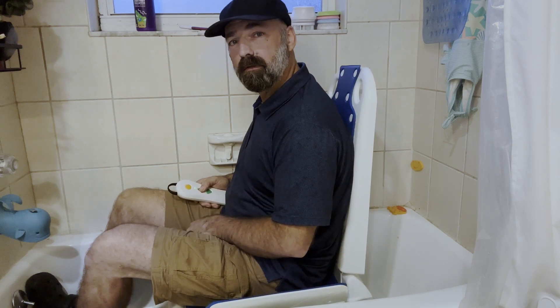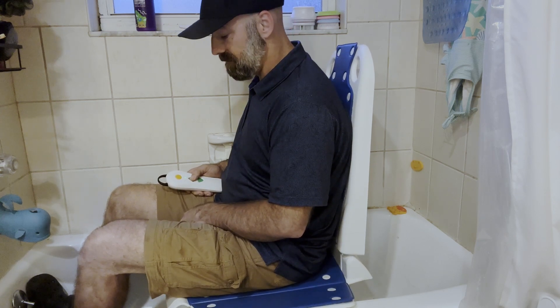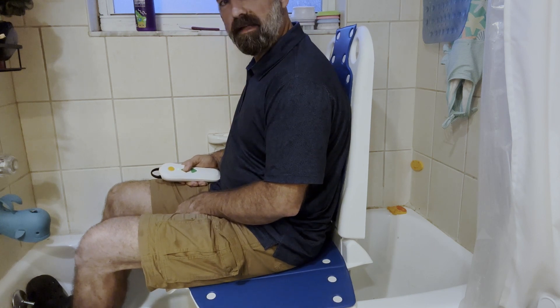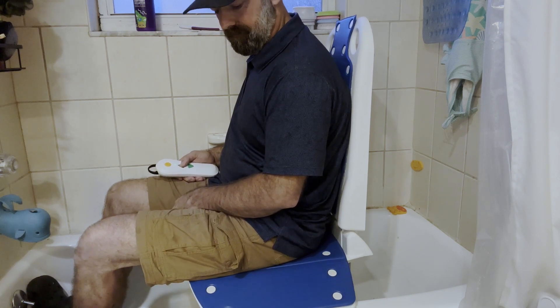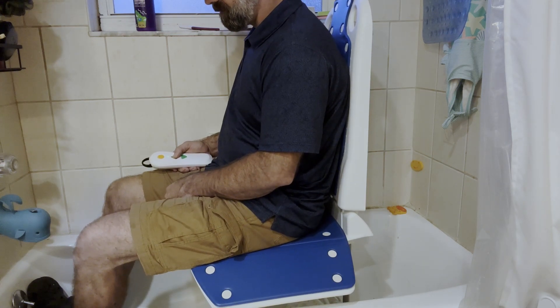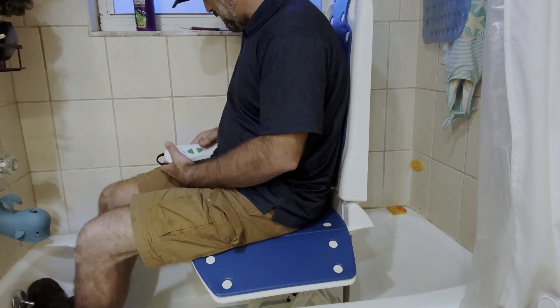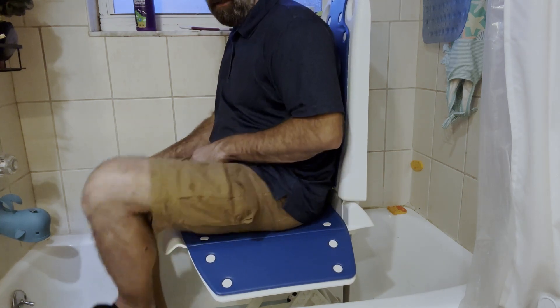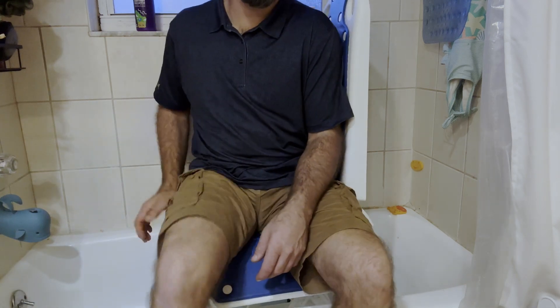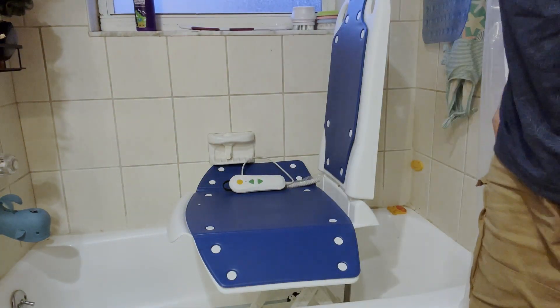How cool is this? Especially if you're in pain or elderly and you still like taking those nice warm baths — this will be perfect for you. Just like that, you can see we've reached the top. Then all I have to do is simply spin like this, even while I'm still seated, and I can just stand up out of the tub.